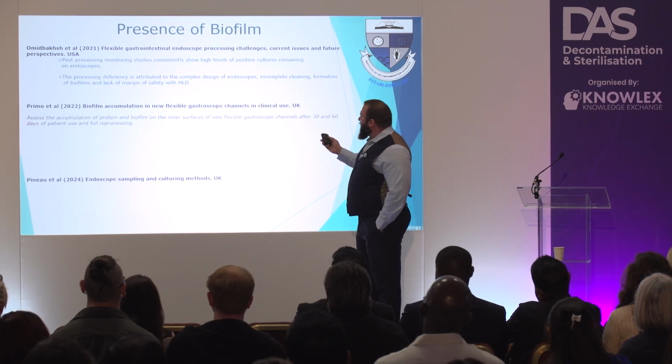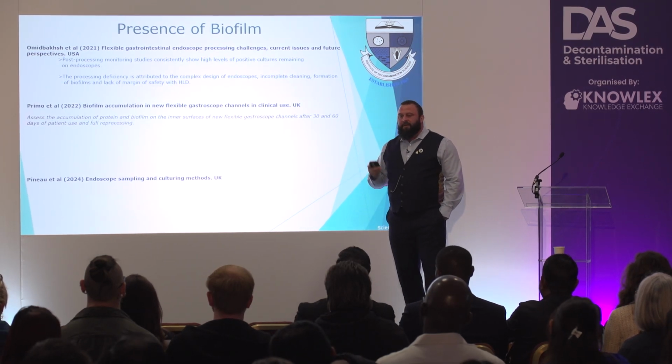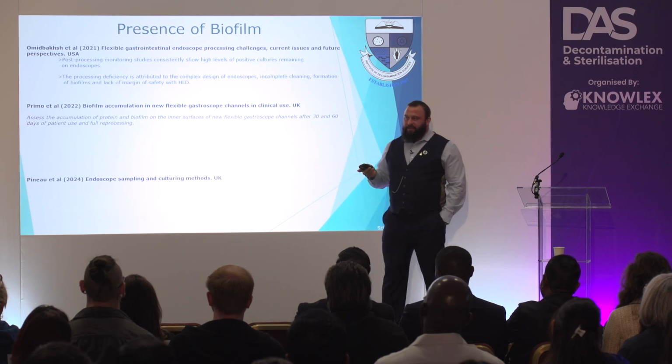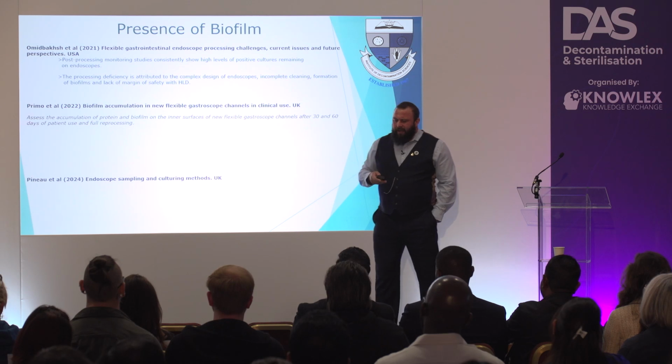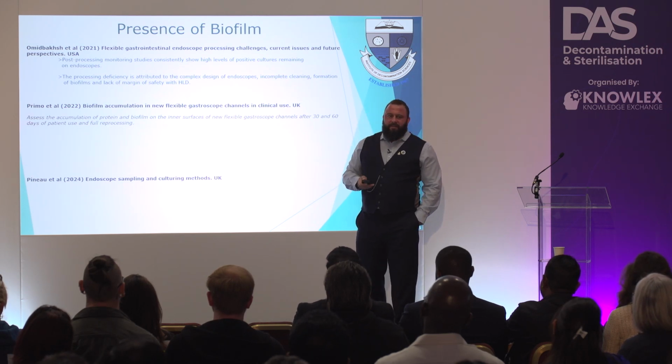So, again, the complex design. We know we struggle to brush all channels. We know we've got particularly the air-water junction where you can't access it in some endoscopes. I think Pentax, they've got one that you can brush most of the channels, but really the design doesn't allow every surface to be contacted effectively.